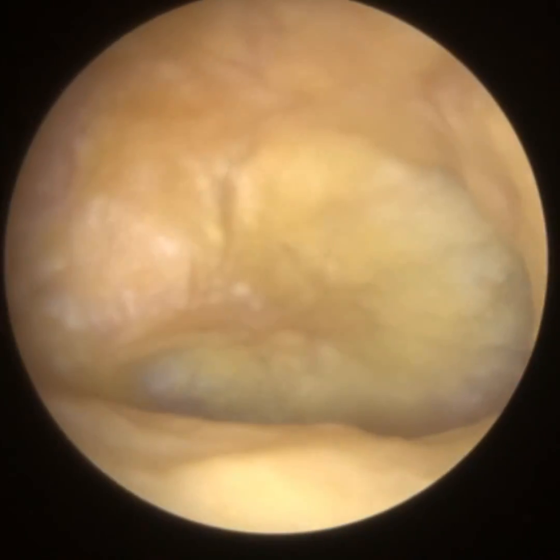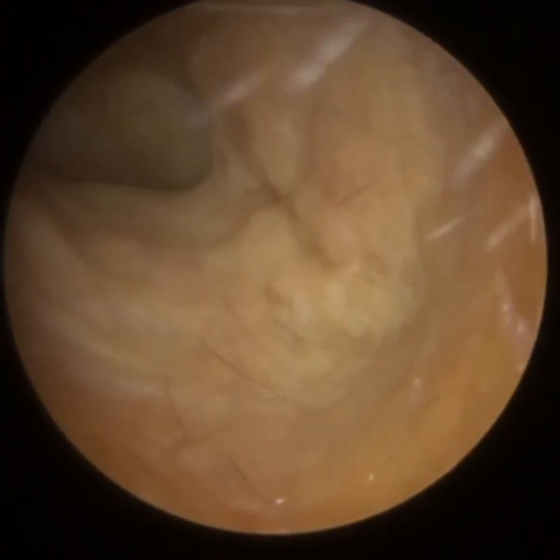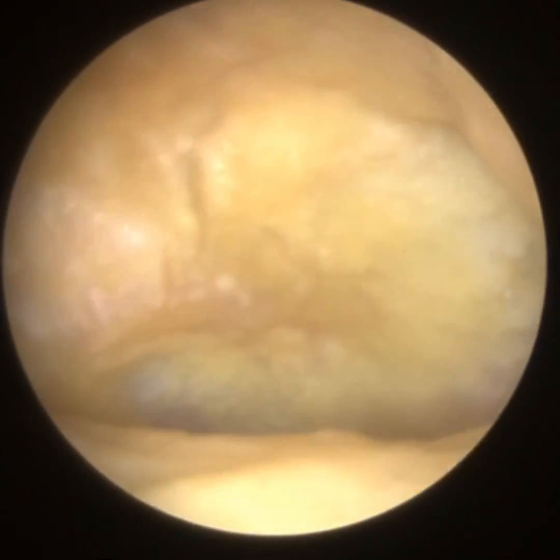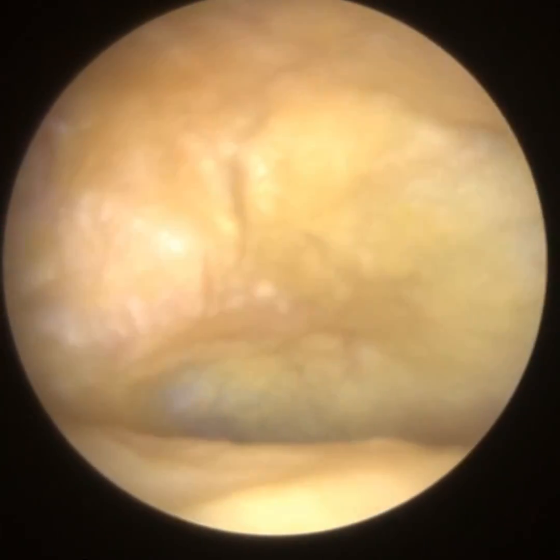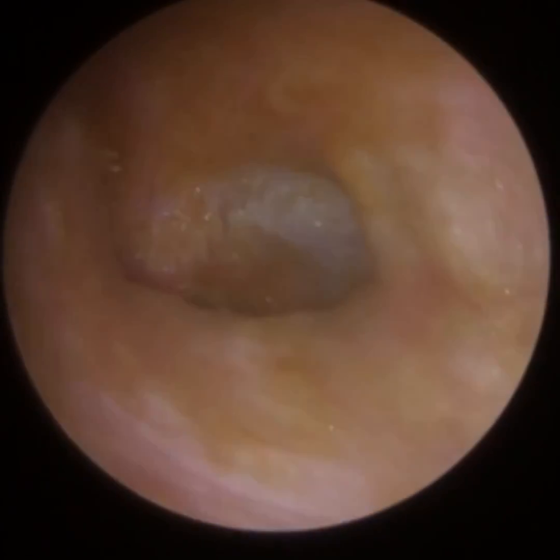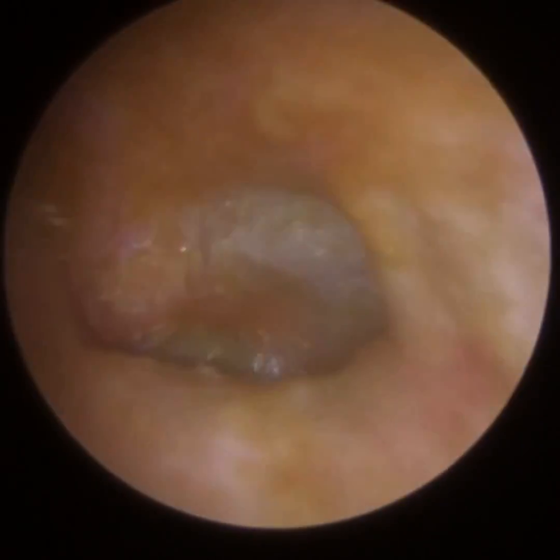So this is a pre-video. This is how the patient came in. You can just see that. You can barely see the eardrum. It's all this gunk lining the ear canal wall. And after 10 minutes with myself, or it was a bit longer actually, in a minute you'll see the post-video. You can just see it's all glazed over. It's very hard to visualise the eardrum. So this is post-procedure, to see the difference there. You're never going to get every little last speck out because you'll be there forever, but just see the difference there.